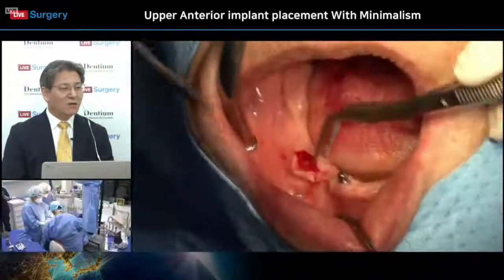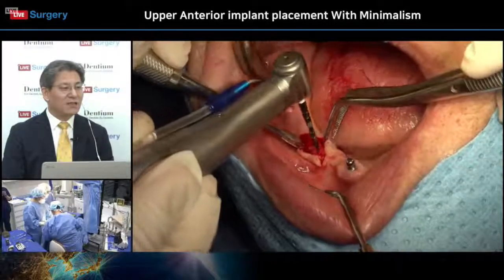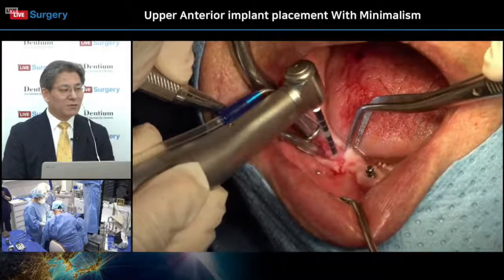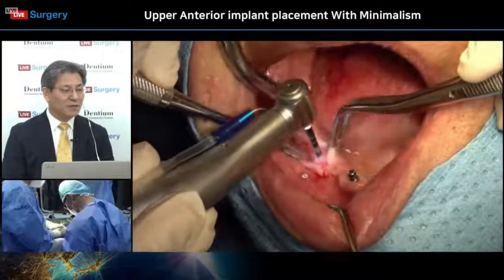So I want to mention about this system. The denture is not the same as the surgical guide, right? The surgical guide is also the top-down style from the prosthetic.